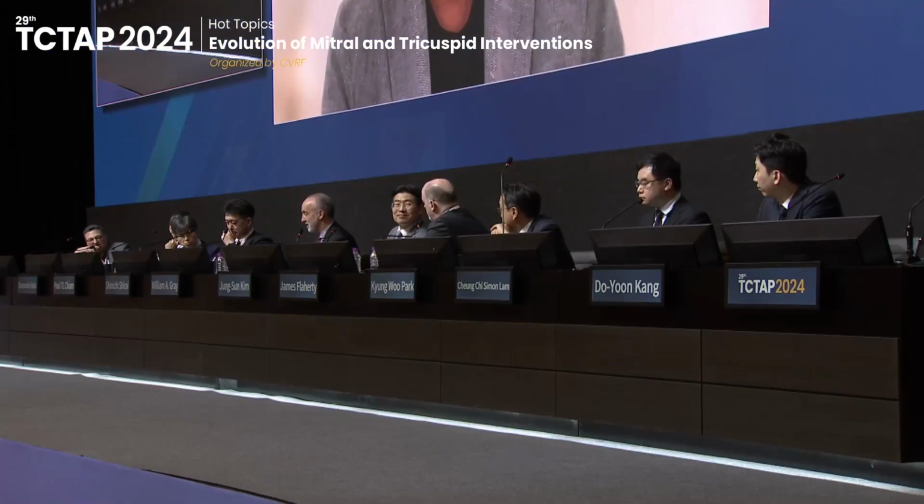I think it's a hard question to answer because what happened over the course of the trial was that we got much better at the sites of selecting patients out. We didn't even submit all the patients that we had. So the selection rate started going up significantly because we all knew that if you had a poor RV, you shouldn't bother even putting it in, or we could measure the annulus ourselves. So I think, Susheel, you can commiserate with that, right?